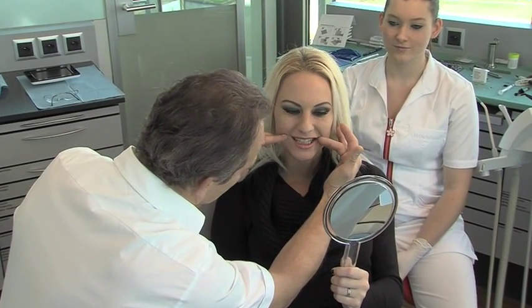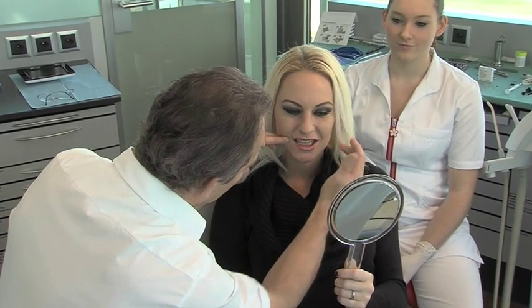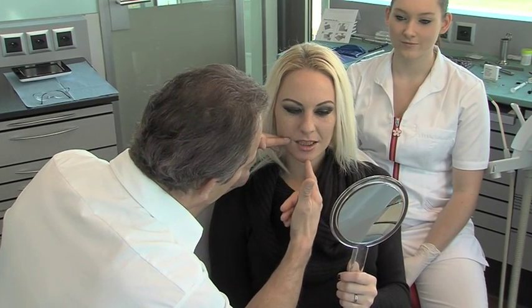Facial symmetry is discussed at the start of the treatment with the patient, including the alignment of the occlusal plane to the bipupillary plane and the midline.